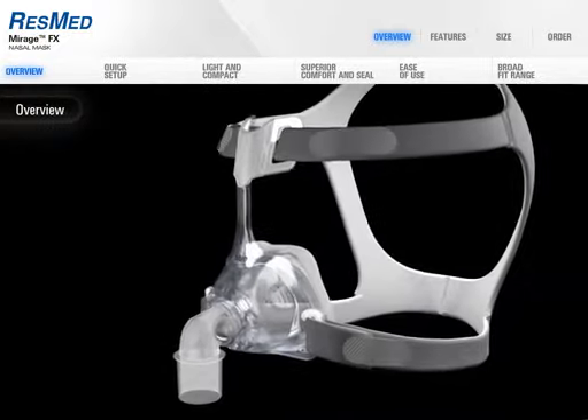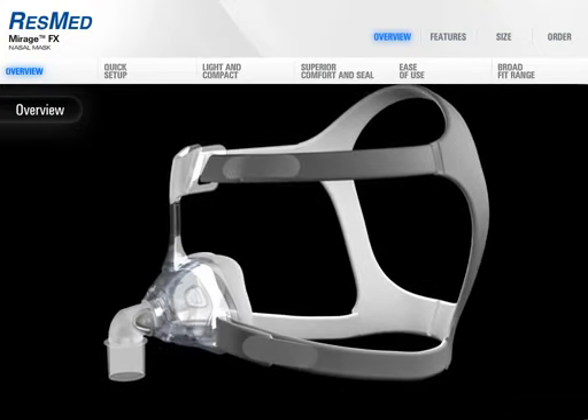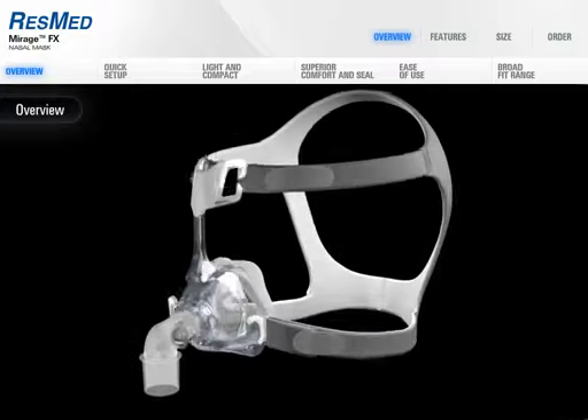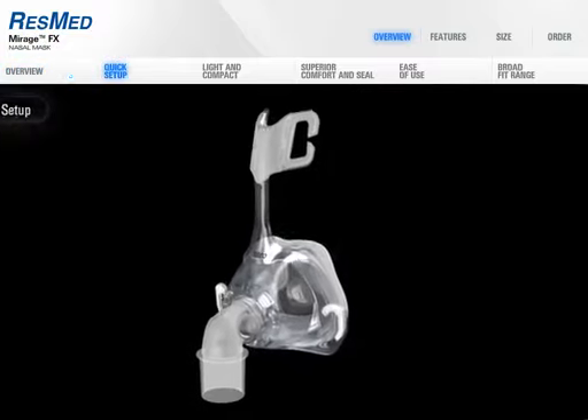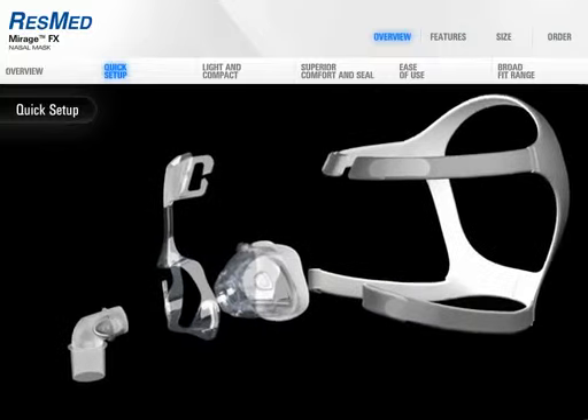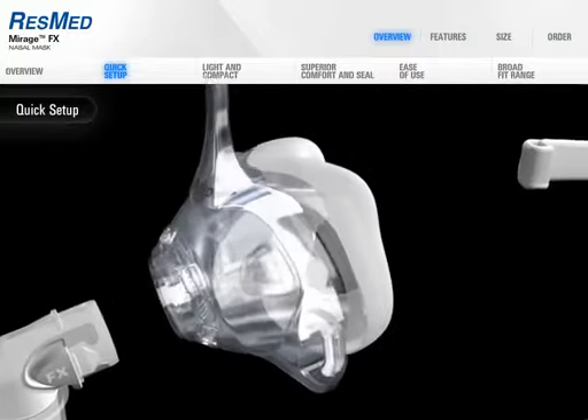Using advanced materials, breakthrough technology, and user-focused design, Mirage FX is a nasal mask designed for performance and comfort. It's easy to use and boasts a broad fit range. Mirage FX is made up of only four parts, including the headgear. This is truly the easiest mask on the market.